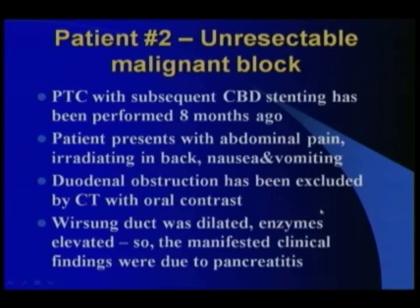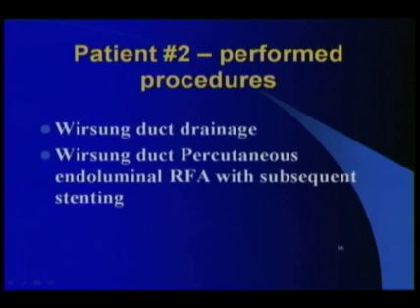Duodenal obstruction has been excluded by CT with oral contrast. Wirsung duct was dilated, enzymes elevated, so the manifested clinical findings were due to pancreatitis.